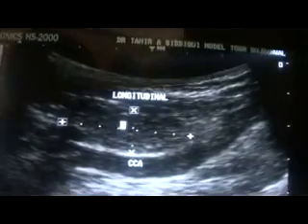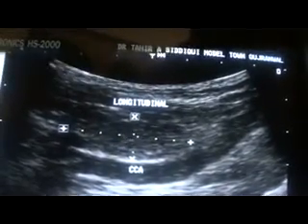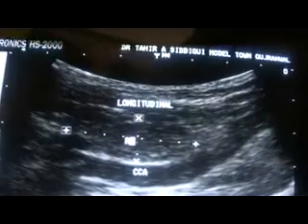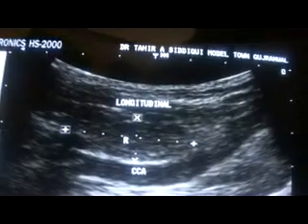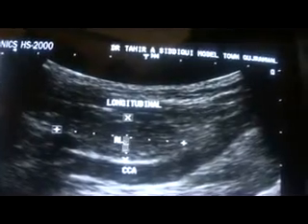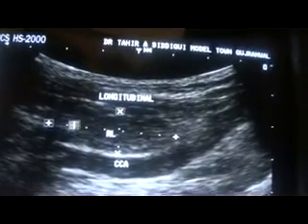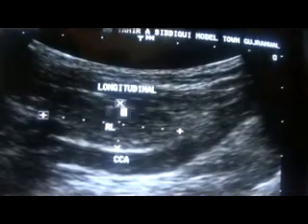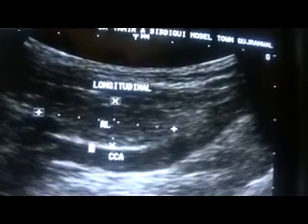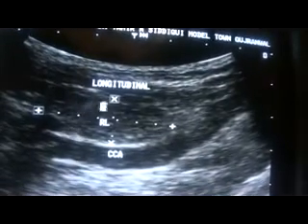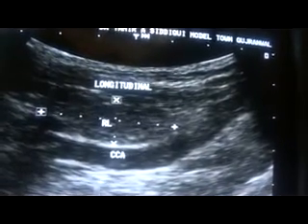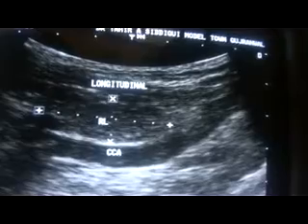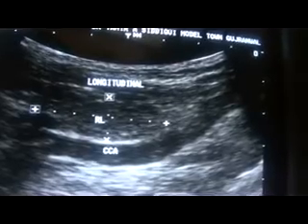This is the right lobe of the thyroid gland. Now let's move on to the left lobe — sorry — left lobe of the thyroid gland.